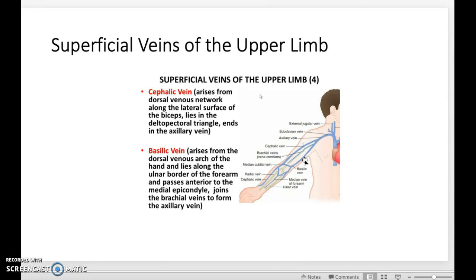And if you can't see distension of a vein after putting on the tourniquet, there's a bunch of things you can do. You can compress edema away from the site. You can pat or rub in one direction and let gravity work for you. Put that arm lower. You can have them squeeze a ball. And also, if you don't see a vein, then just apply heat for 15 minutes and come back.